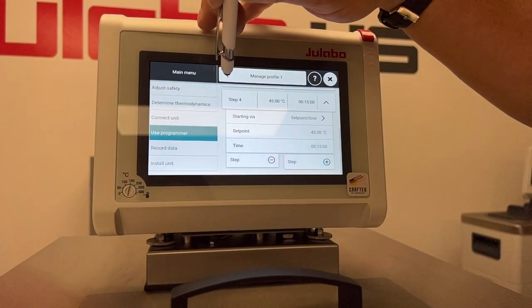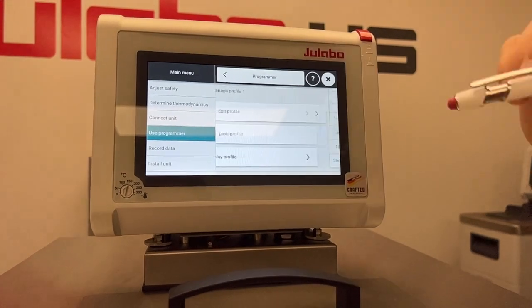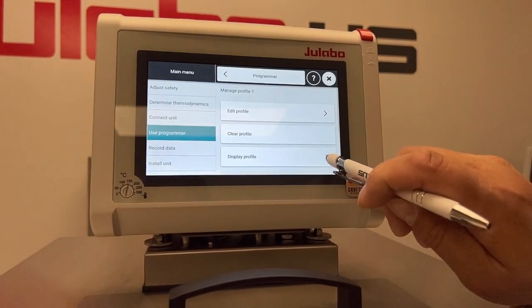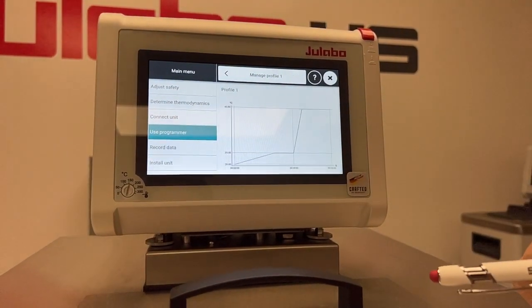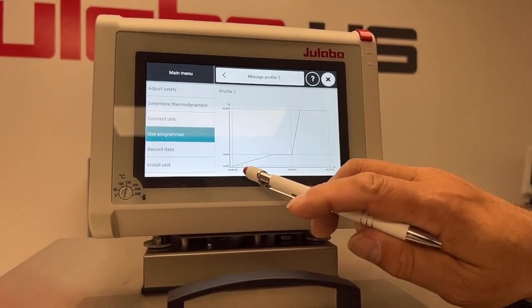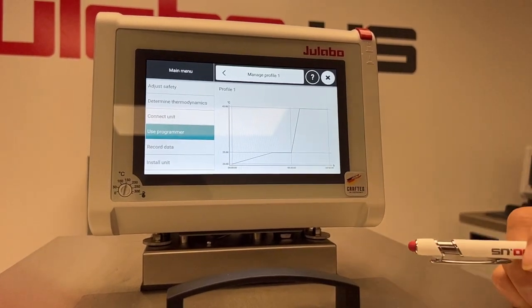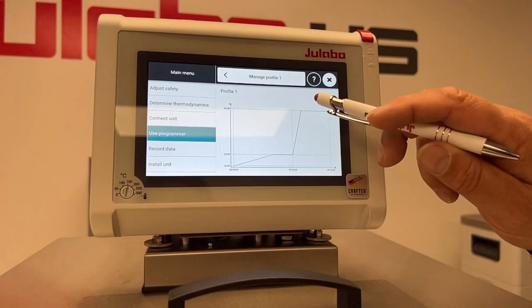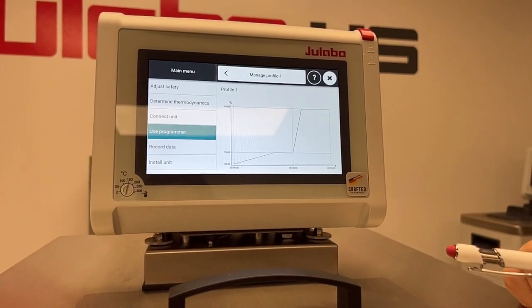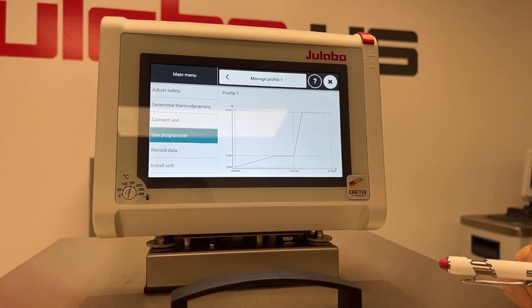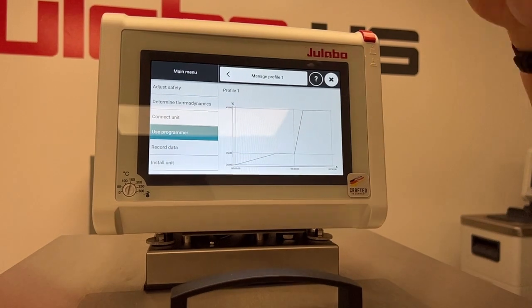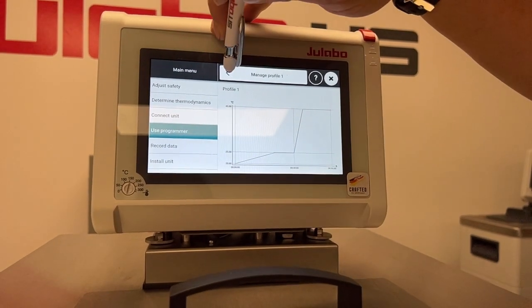So now that we've got our profile programmed, if we click the Display, it's going to show us the various rises and hold steps that we've programmed in graphically on the display.